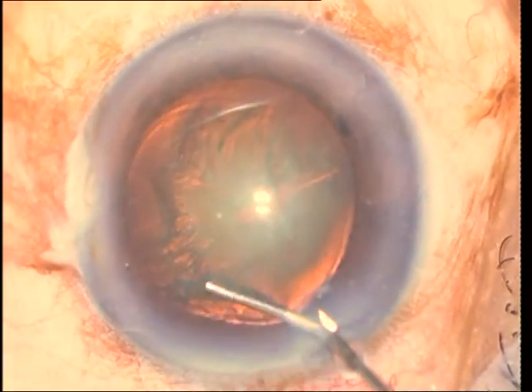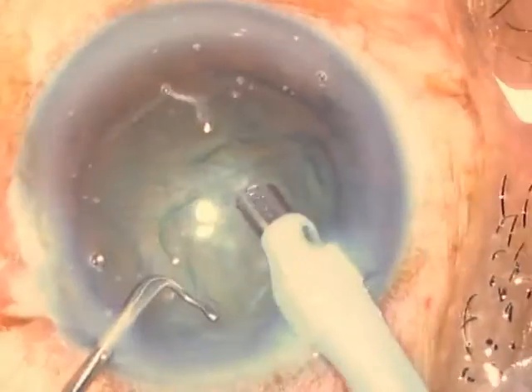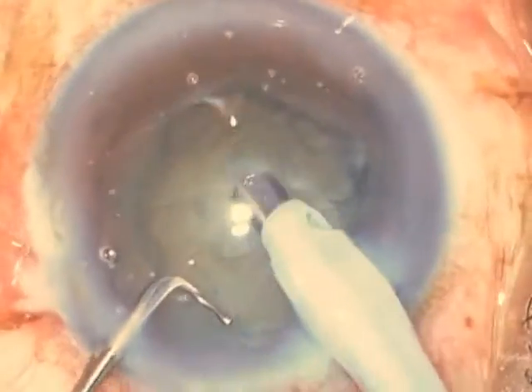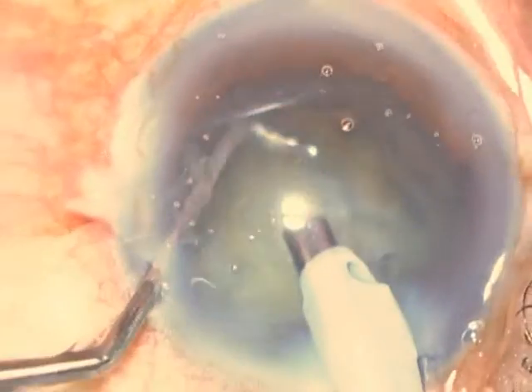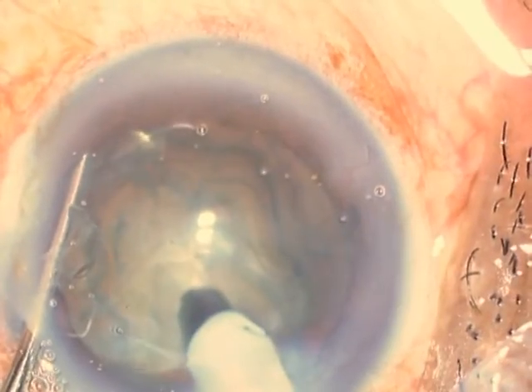Hydrodissection is performed in order to get a mobile nucleus, and you also do a good hydrodelineation so that you get an epinuclear shell. What I do next is clear the superficial cortex and epinucleus under the exposed area of the rhexis rim.